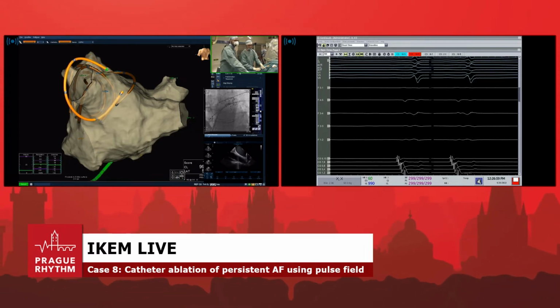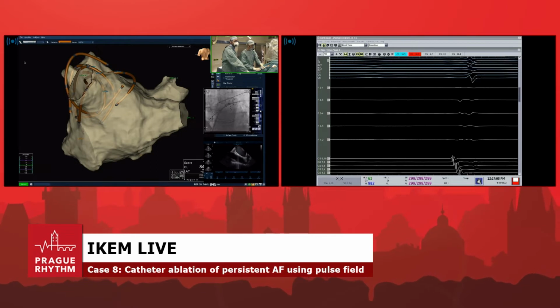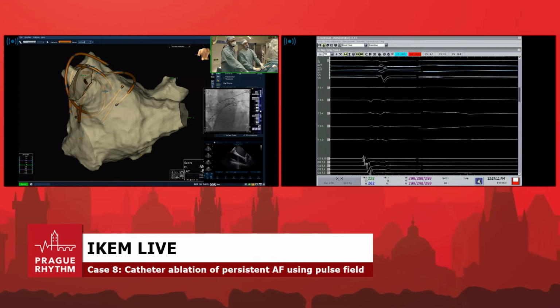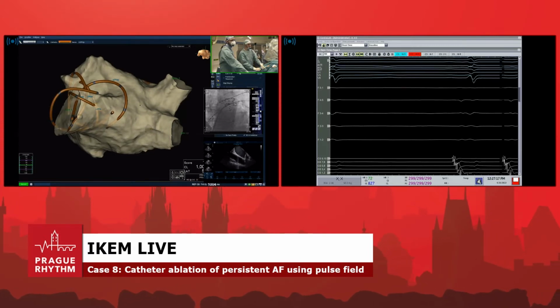So this is a LIPV anchor, pulse 1. Jan, can you show us the image from a superior view? Go. Yep, this anchor. Now you see that we are hugging more of the posterior wall. Thank you, Predrag. You see it nice, yeah. And LIPV anchor. Good. Thank you, Jan.